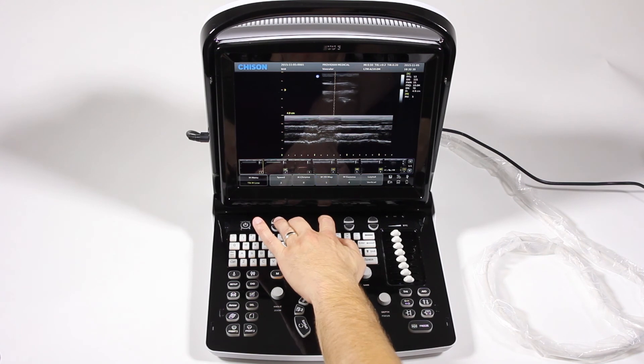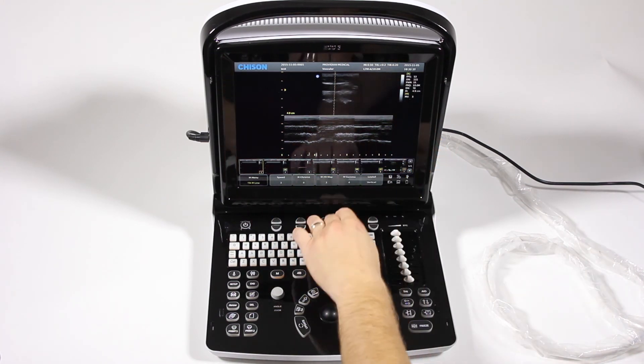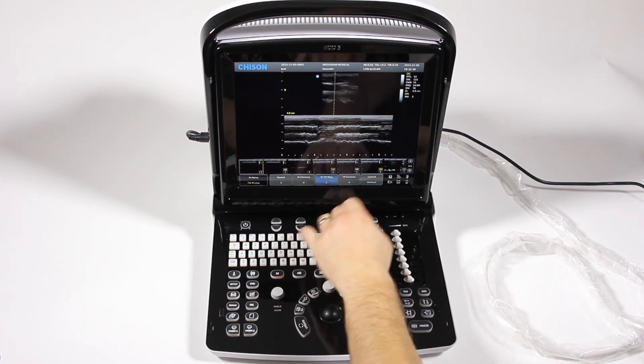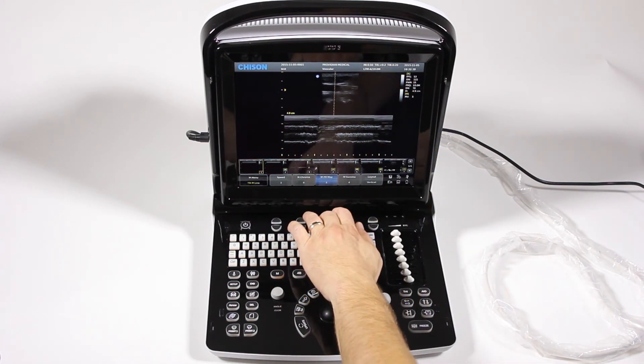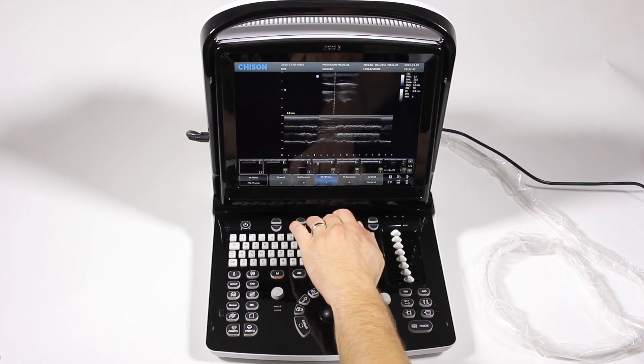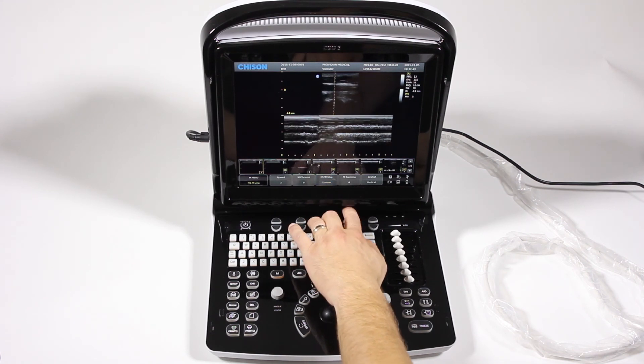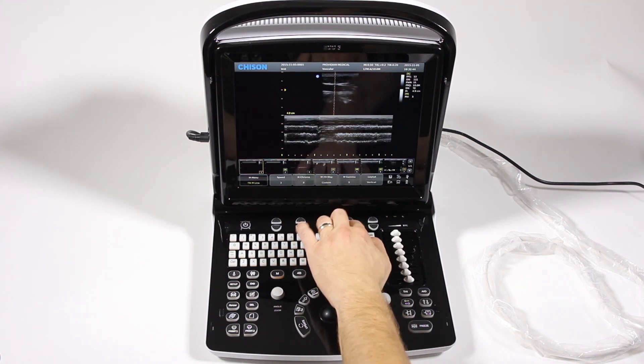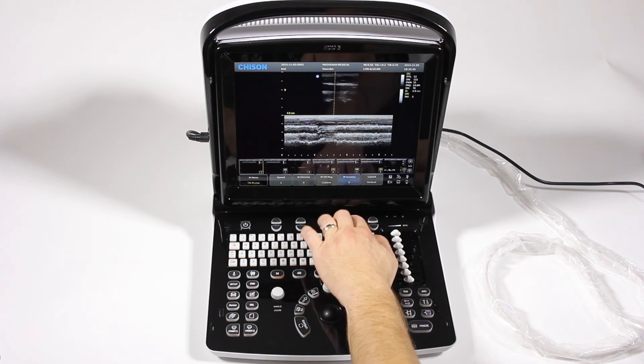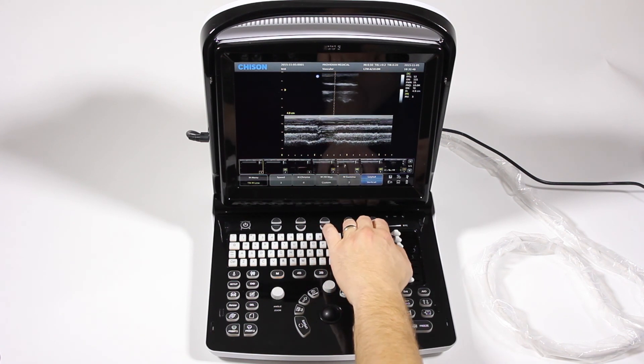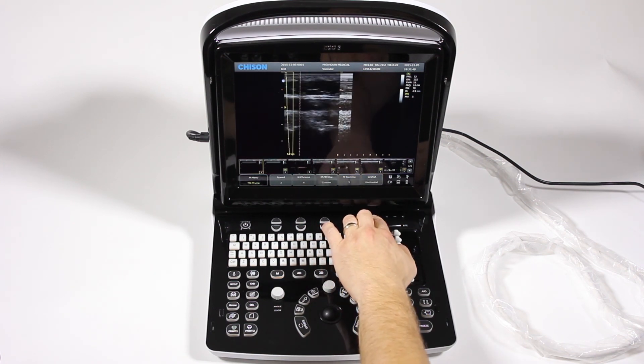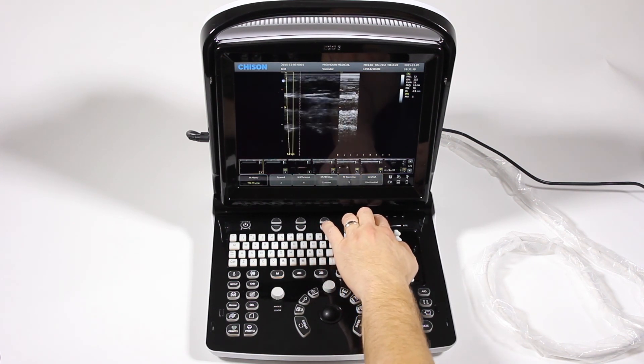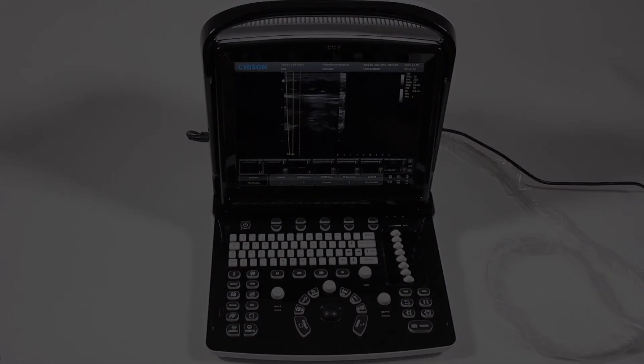The 2D map for your M mode, you can see that change up here. Your grayscale is just going to change the grayscale for your M mode. Gamma is just an overall brightness of the image. And here's that layout again for different ways of looking at it.